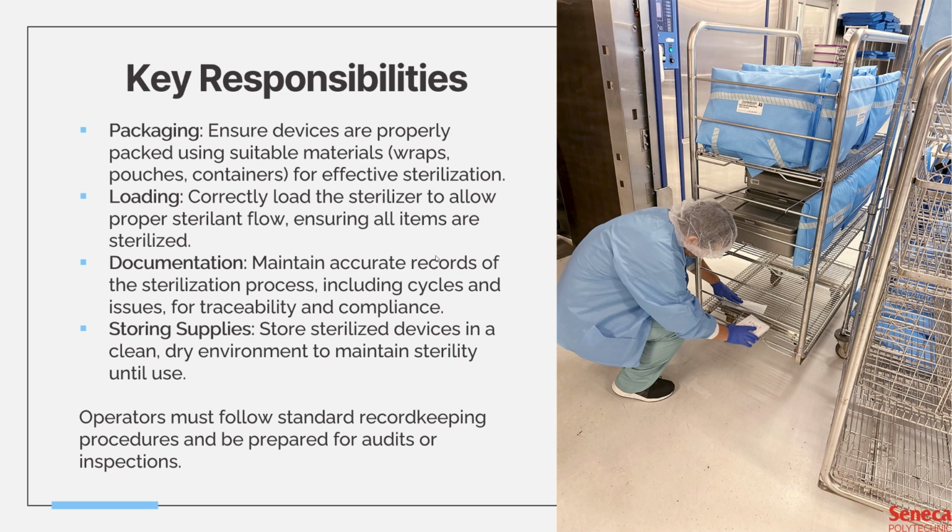And loading is completely the sterilizer technician's responsibility. And like I said, it's very critical. Items should be arranged to allow steam or other sterilants to circulate freely and reach all surfaces. Overloading or poor arrangement can block sterilant flow and leave items unsterilized. And I'm just gonna judge this sterilizer's work right now. This is not a very good way to load a manifold or loading carriage. There's already so many inconsistencies to it.